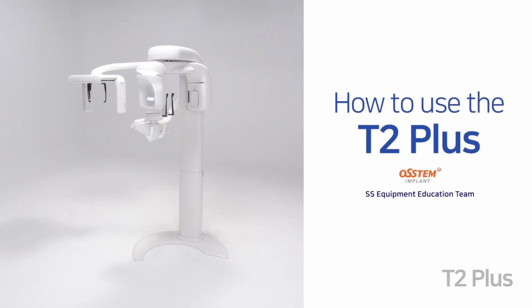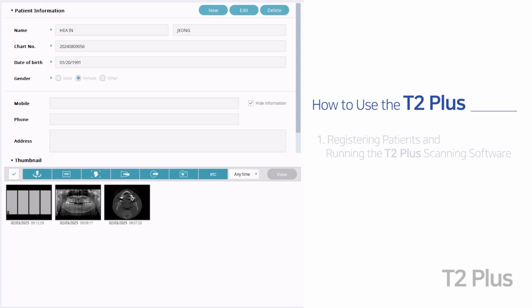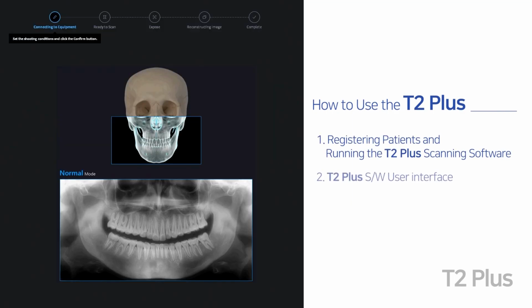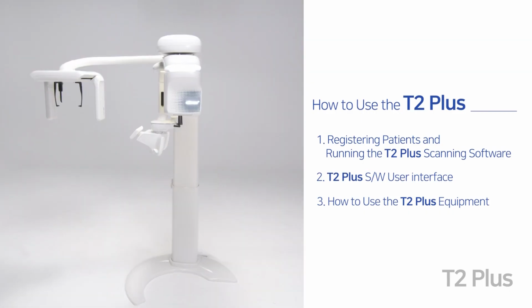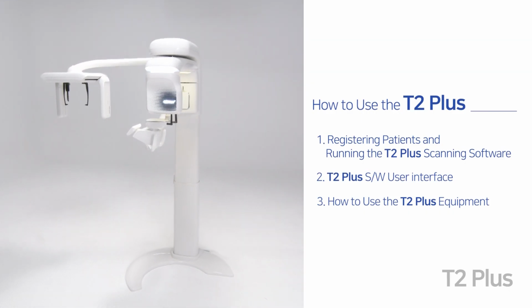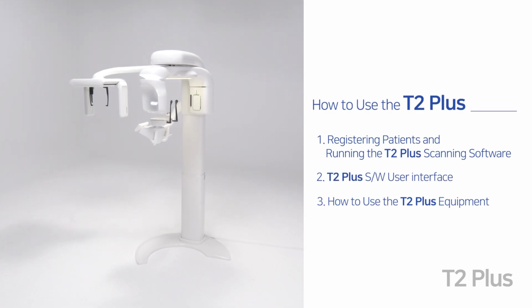Let me show you how to use the T2+. First, registering patients and running scanning software. Second, the T2+ software user interface. Third, how to use the T2+ equipment. We'll be looking at using the T2+, focusing on these three areas.